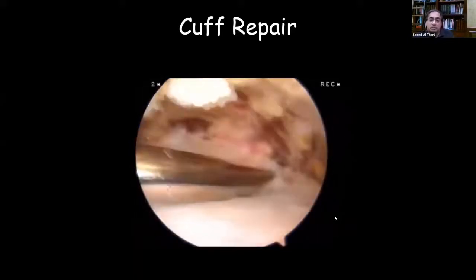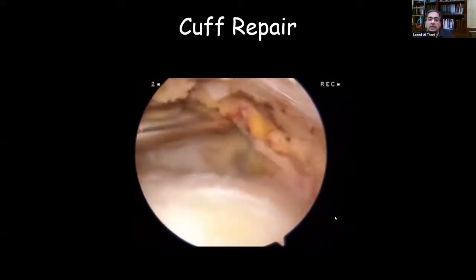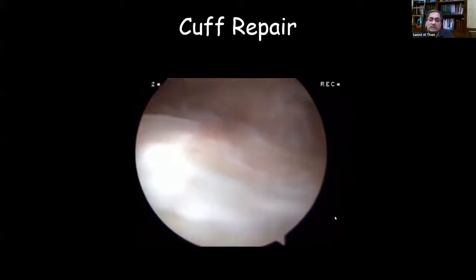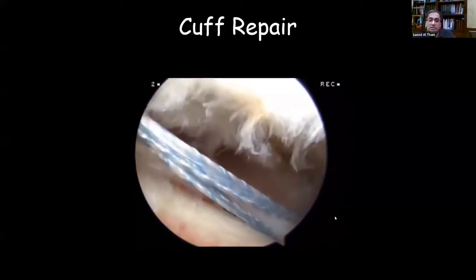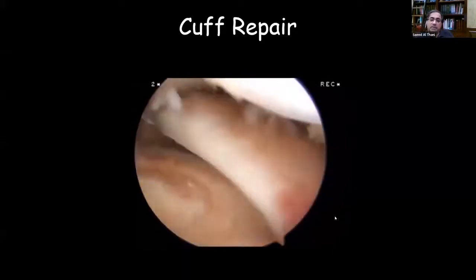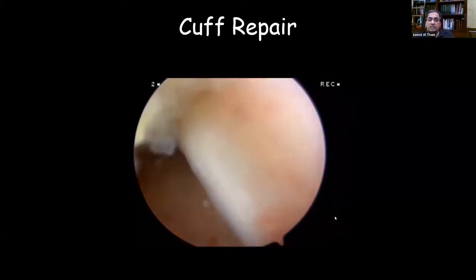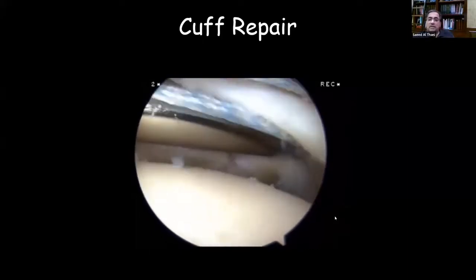You have to go on the top of the tendon and release it adequately. As well, you have to go between underneath the tendon and take especially the capsule or the scar tissue that formed between the superior glenoid or the labrum and the cuff itself. So we have adequate release here to start with. So we can see it is coming more.